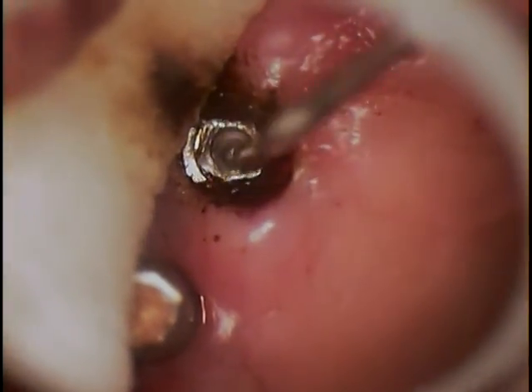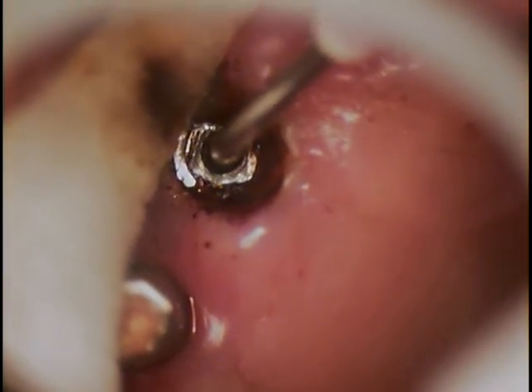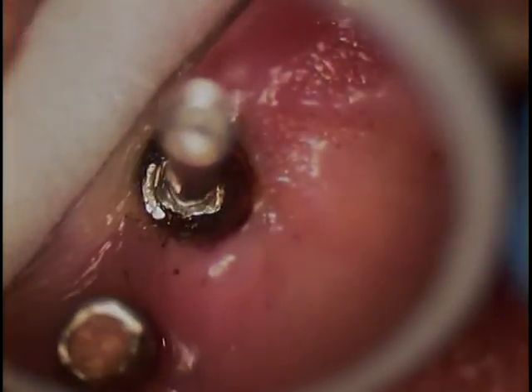New cotton roll. Get my screw back. We got at least three millimeters. That's a lot. He can torque it down a little bit more and get a good result.